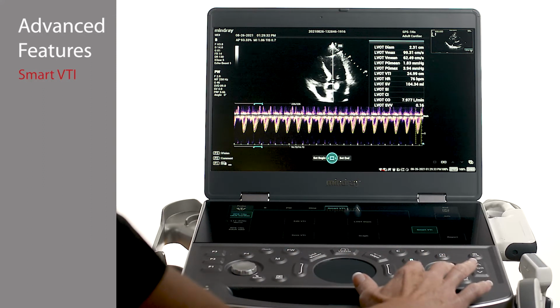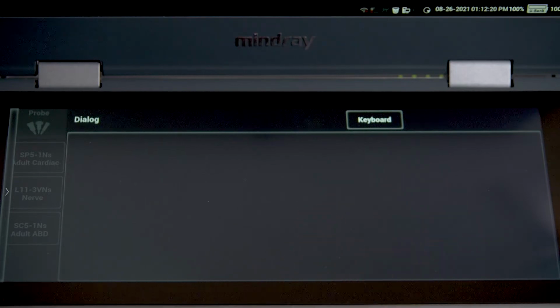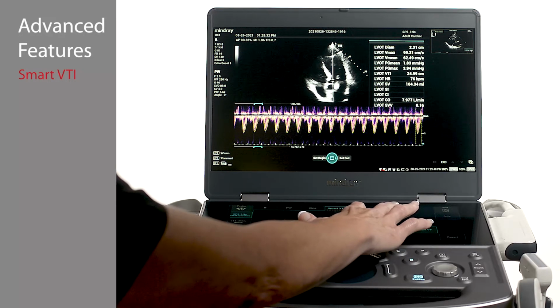Press Freeze to stop the Doppler acquisition and analyze the data. An LVOT diameter is necessary to calculate a stroke volume and cardiac output, so if it was not manually measured earlier, use the LVOT diameter tab on the touch panel to enter a numeric value.